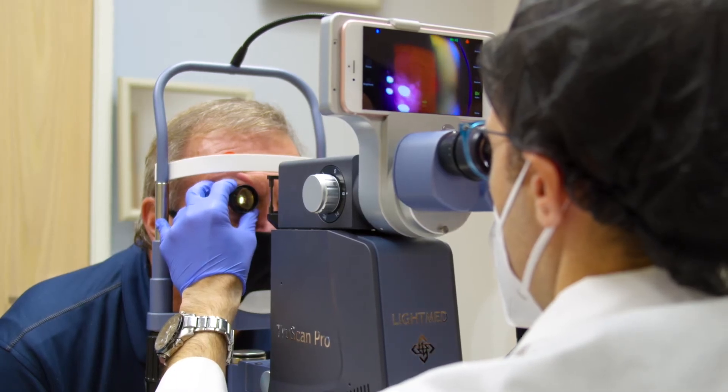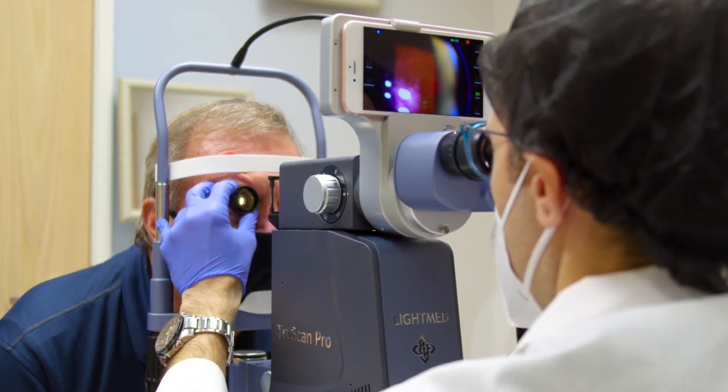TruScan has been a great addition to my armamentarium in the office. I've had the pleasure of working with the TruScan and use it to treat many patients with retina conditions, and it has really improved the flow of my clinic because of how easy the machine is and how comfortable the patients are during and after treatment.